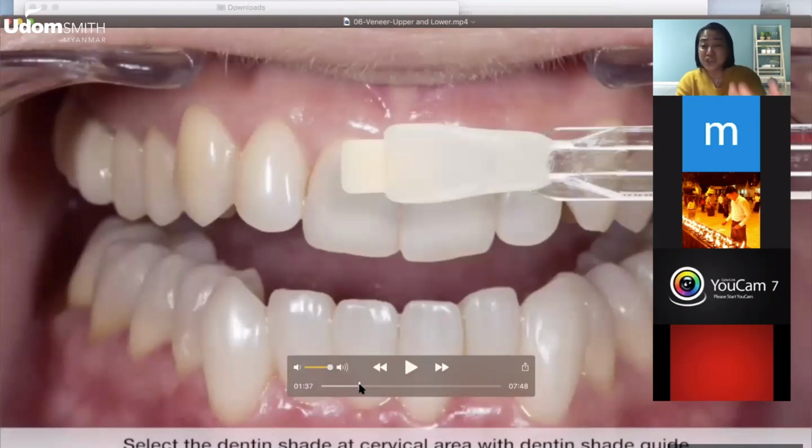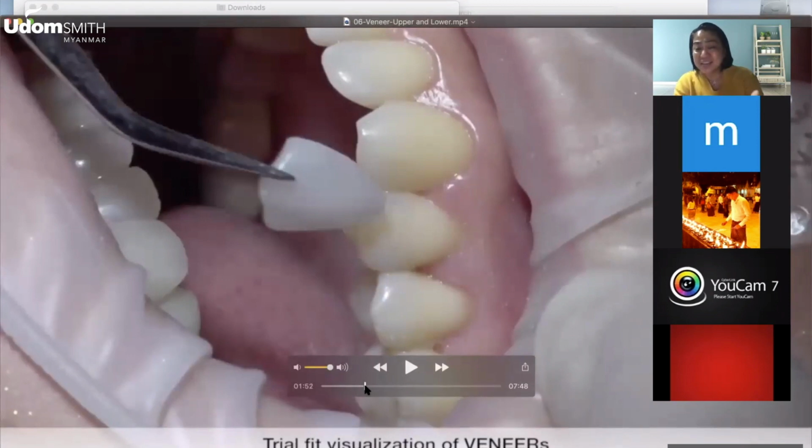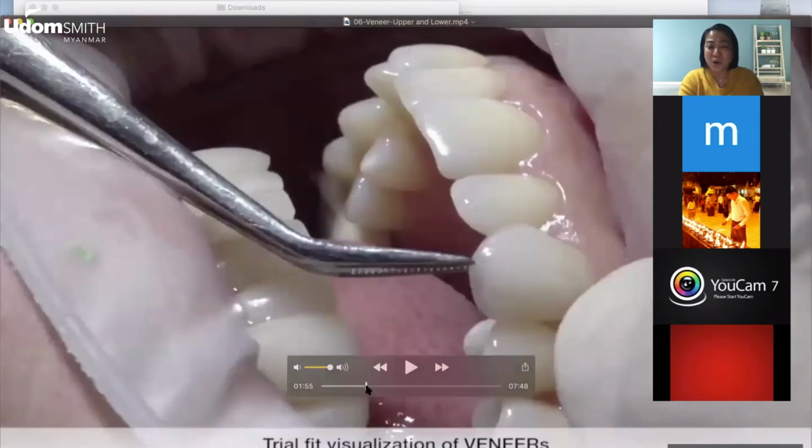Now, again, you can choose the shade if you want, but as I've said, if the shade is okay and the patient is happy with their own shade, do not make it complicated. Just use the enamel shade of Edelweiss. Okay? And then, this is what's nice about Edelweiss. You can actually pre-trial it directly. So, you can use an expired composite and just place it on the tooth to see what adjustments you need to do. You can actually use this for marketing as well because you can clean it up later and autoclave it, because Edelweiss is autoclavable.